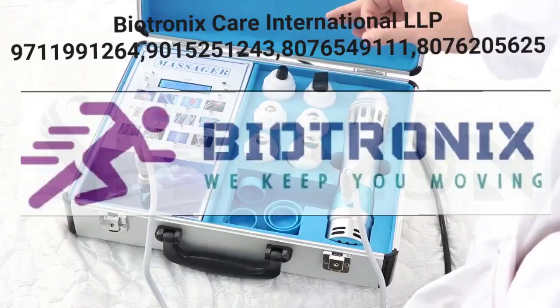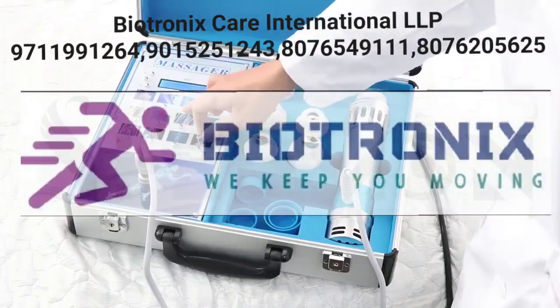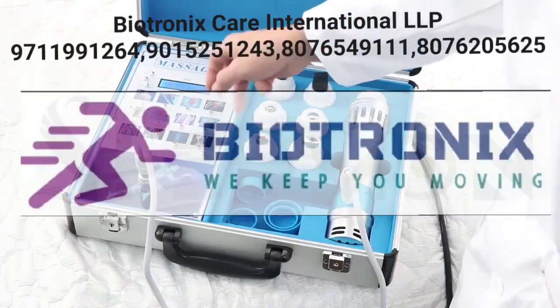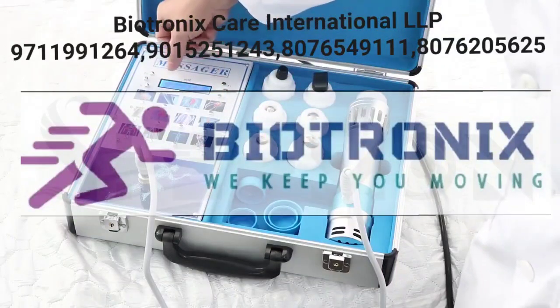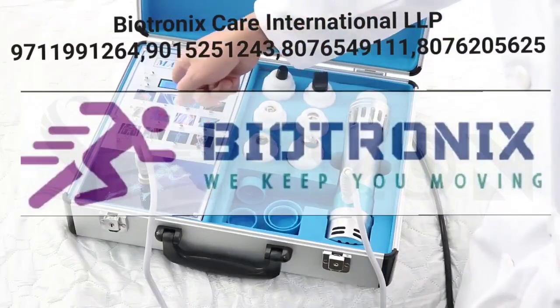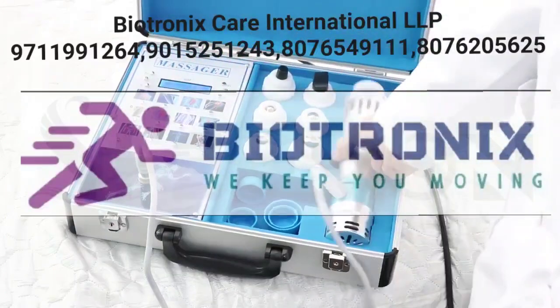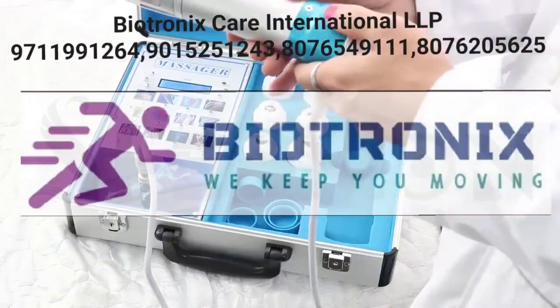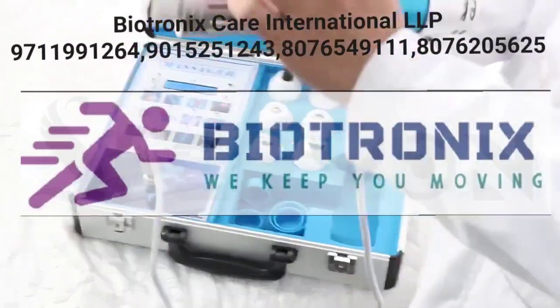It's a more flexible model. For each of the treatments, you just select and press. The system has already fixed the data for each treatment for you. Over here you will see it's fixed data treatment. You just use different tips for treatment, and this is the temperature. It's the handle temperature, because when you do the treatment, the handle will keep heating. You will hear the sound later on.